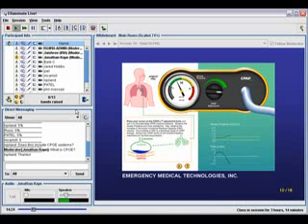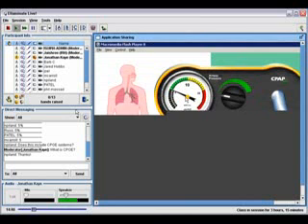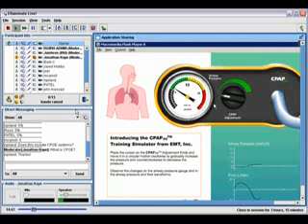It wanted a simple way where people could get a hands-on feel for what the device was capable of and its particular intent, and later tie that into an in-service where they document how people perform on case studies. So what I'm going to show you now is a CPAP device. It's very simple, with only a single knob. Over here on the left-hand side is the airway pressure, and it's giving a little graph in the bottom right of the airway pressure and flow.